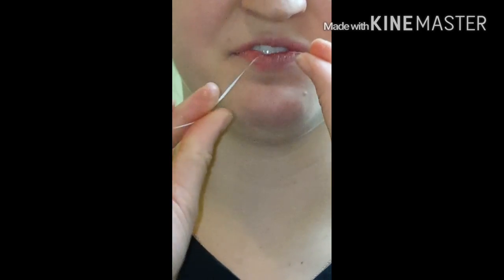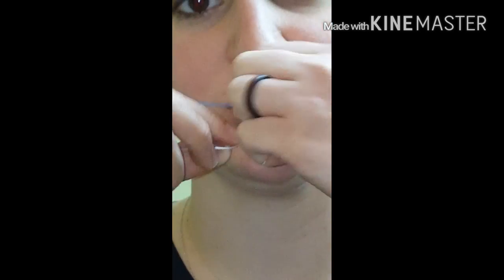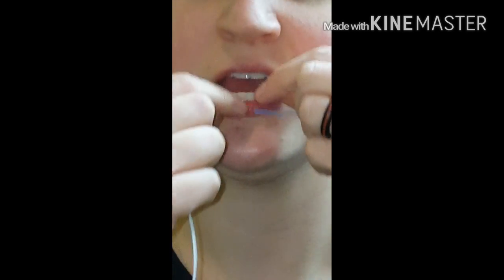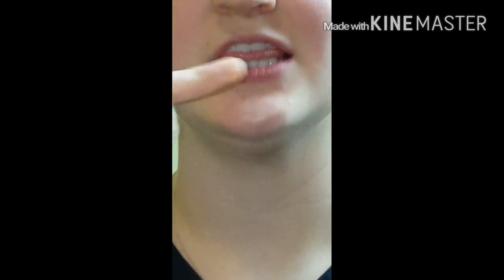All right, once you've got your floss threaded through both sides of your retainer, you want to take the floss and do a C-curve to each side, making sure to floss each tooth efficiently. Then, as you saw, you want to delicately hold your finger in place and slide the floss out to make sure you're not pulling up against the retainer, which can damage it.